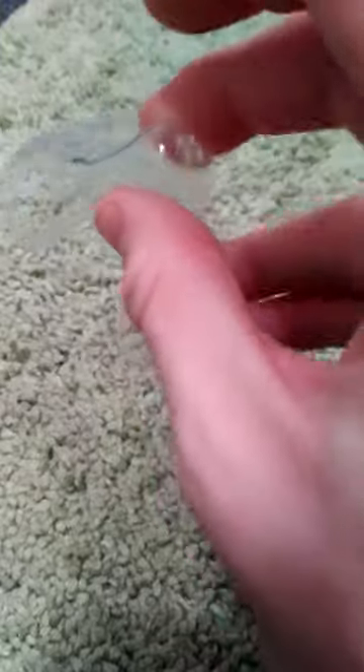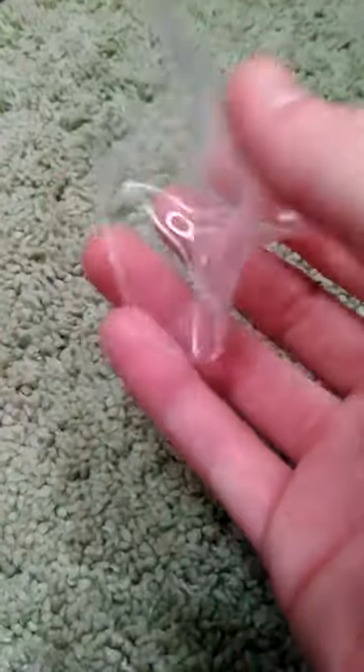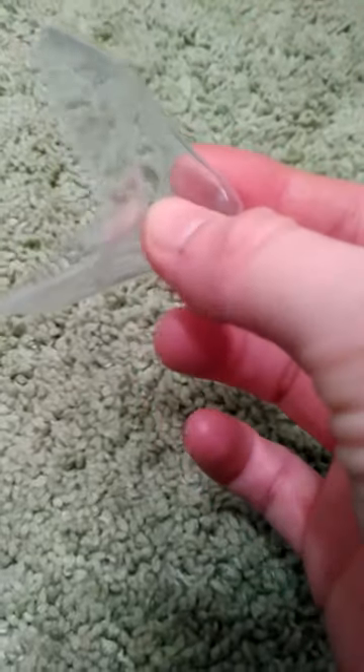I've never used a nipple shield personally — I just dealt with it and used creams and whatnot. But for those that have used one, you could consider using one of theirs. It's a lot easier than hard plastics. Like I said, it's very moldable — you can pretty much do anything with it.